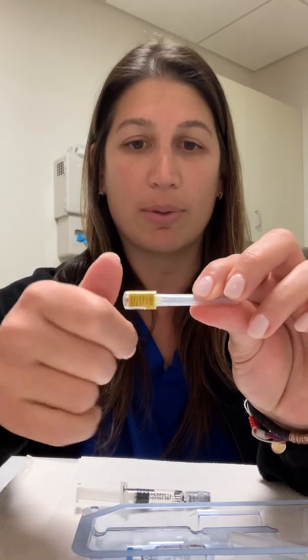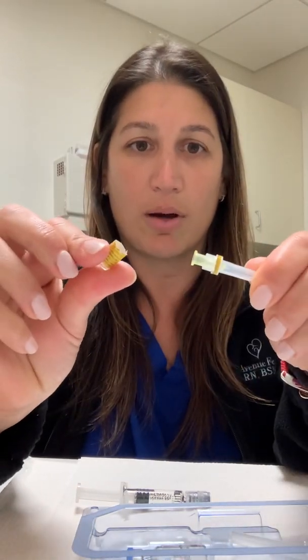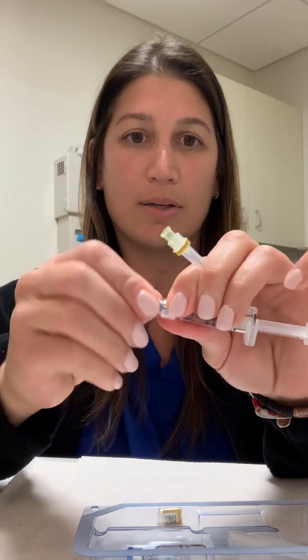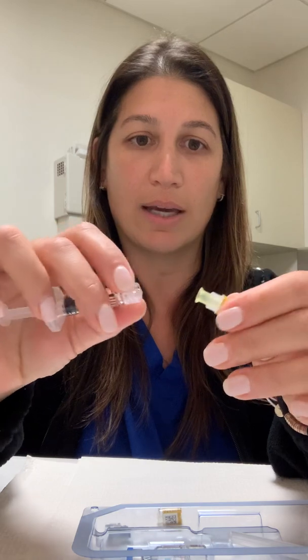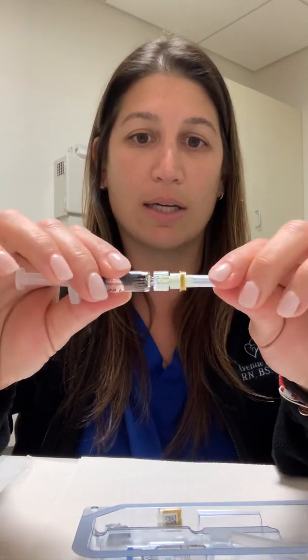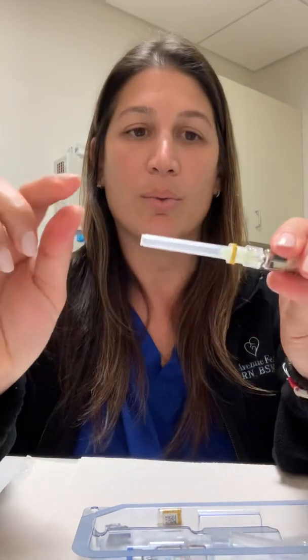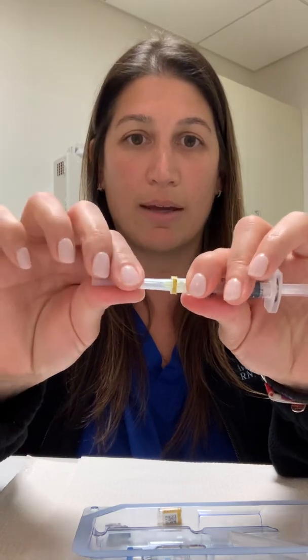It has a sticker wrapped around it — you're just going to twist this apart and it'll come off like that. You're going to take the syringe, hold the base, and twist that cap off. Take these two, holding the base again, and twist the needle on. Once you have the needle on, give it a little press just to make sure it's still attached. When you go to pull the needle safety cap off, hold the base and pull those two apart.